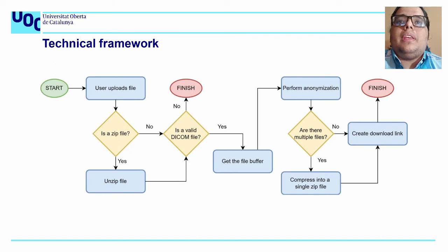And here we have the whole process that is implemented in the application. So we start. The user needs to upload files. Here we have two ways to do this.